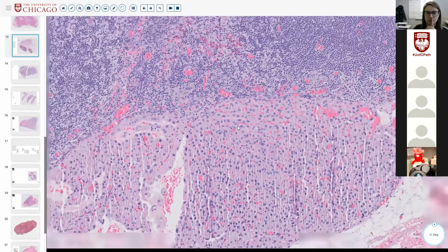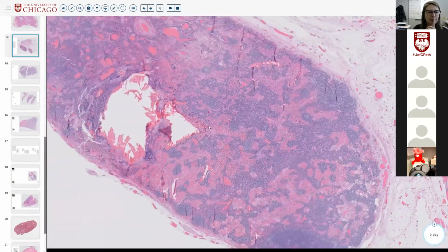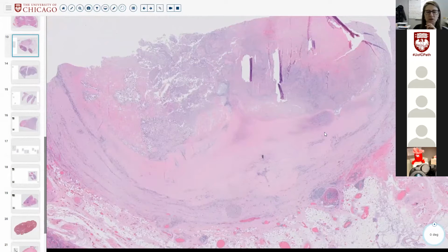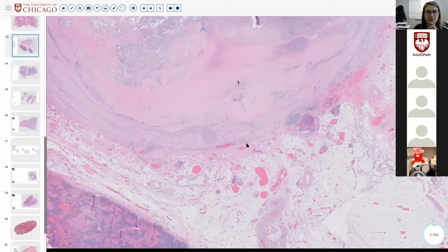Looks positive. So remember that not only papillary carcinomas, but also Hürthle cell carcinomas are ones that go to lymph nodes. All right. So you might think, but this is a follicular carcinoma. Yes, but it's that Hürthle variant. And so those more frequently have lymph node metastases.